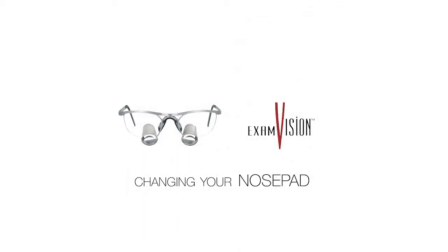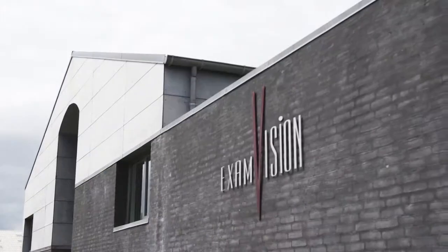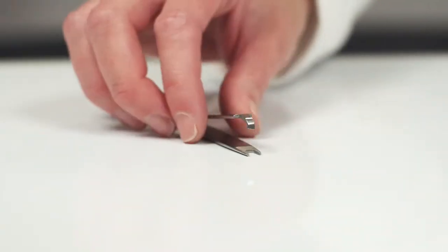Changing Your Nose Pad. The nose pad of an ExamVision loupe is made of super soft, allergy-tested material. It will need replacing from time to time.